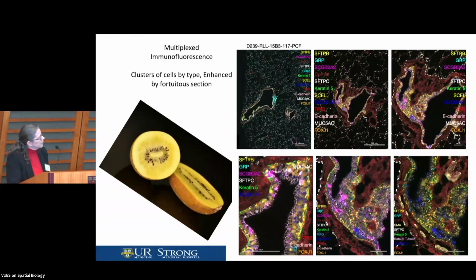Well, what I'm showing you here with the kiwi is if you cut it longitudinally and you section it down far enough, most of you are very good at visual orientation, so you'll understand what I mean. You'll get down to a point where you can see the bottom half of that tube, that airway that's moving through there. And the two images over to the right-hand side show you that. So here we're seeing now patches of these different cell types identified by color.